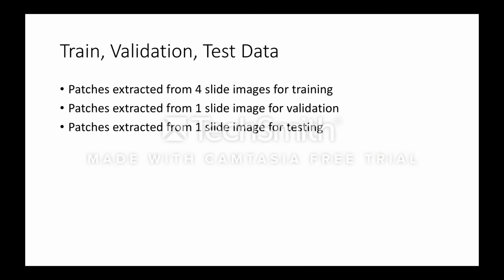Moving on, I used four complete slide images at level 5 to get my patches for the training data. Then I used one slide image for validation and one slide image for testing. All of these patches have been extracted from the image at level 5.